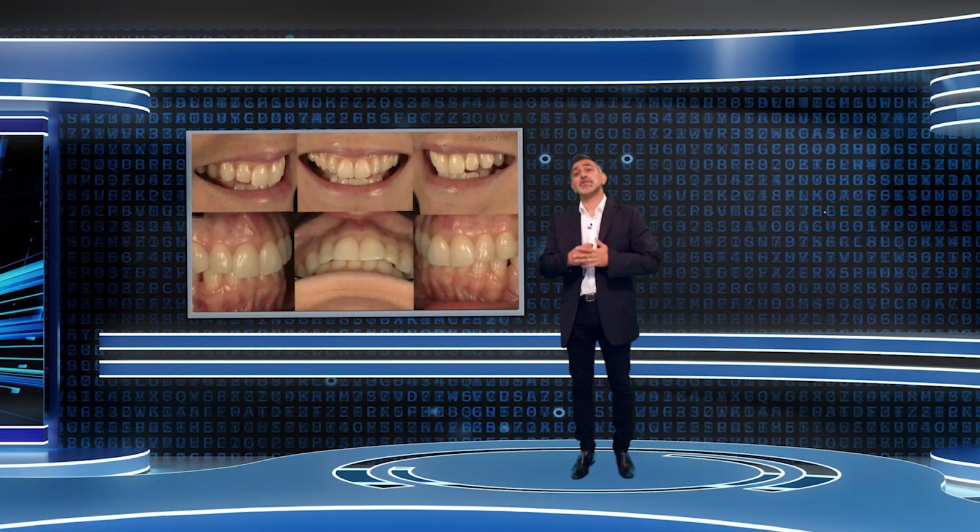So let's take a case. This is actually my wife, and we used SureSmile Aligners on her. She had had ortho as a child, arguably not the most successful case, and you'll see her case close up in a second. She had ortho as a child, supposedly comprehensive and some extractions, no long-term retention ever provided to her.